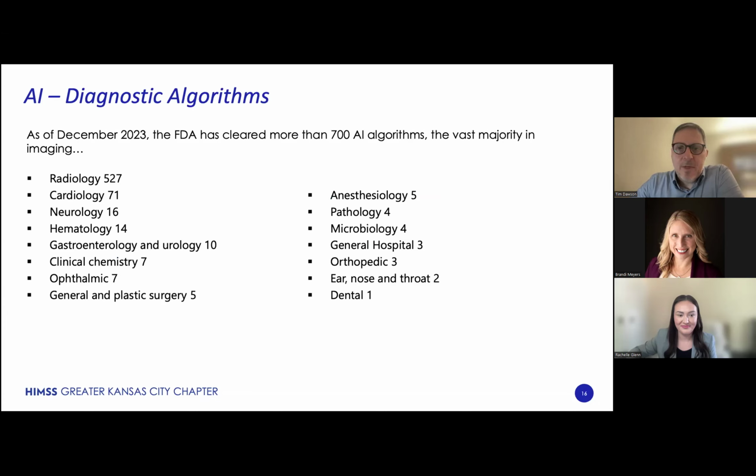So a lot of people think of AI as a tool to replace radiologists. Now, I don't think that. I tend to think that radiologists that use AI are the ones that are going to replace radiologists that don't. But when most people think about AI and diagnostic imaging, they're thinking about image analysis, sending images in and getting some indicator or new image back to identify an anomaly or pathology within the image data itself.